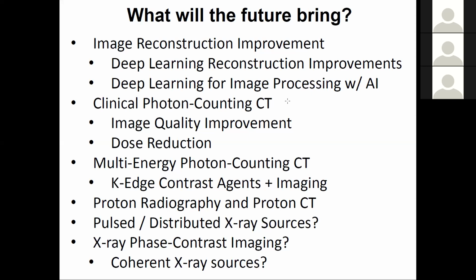You say, oh, you can never do that in CT. You can't choose your sequence because the thing's spinning around. Well, if you're virtually spinning by having it excite the X-rays at different places on your source or distributed around, then it's different. That's all very speculative and exotic, but that's what the future is for.